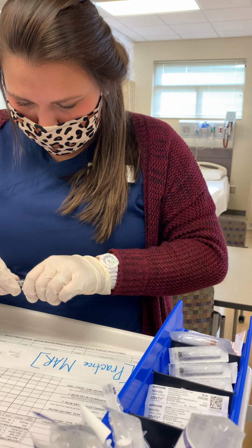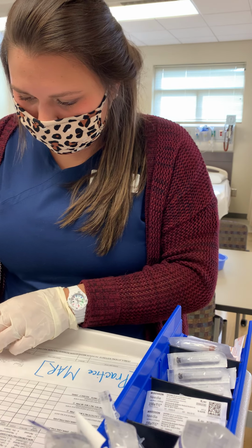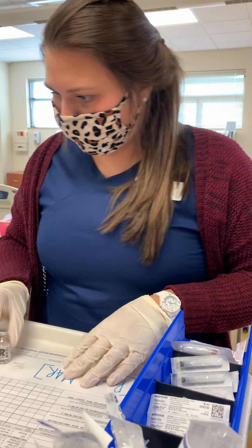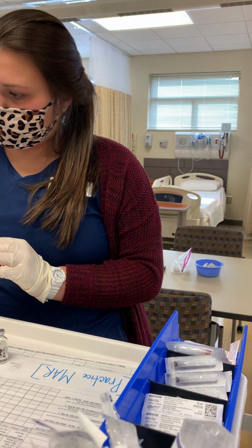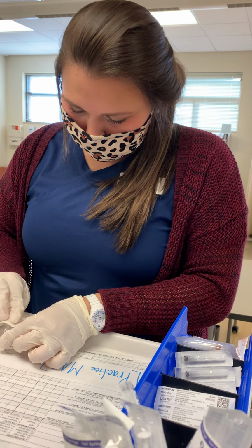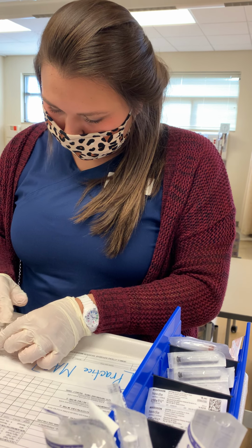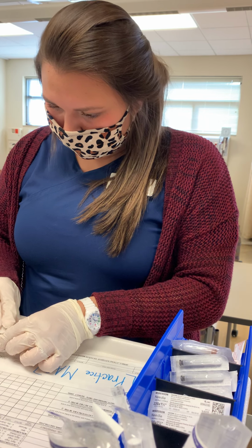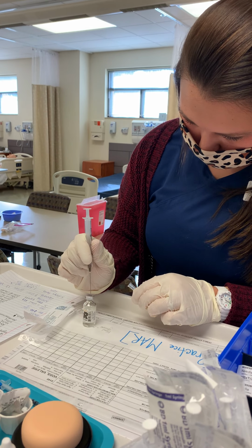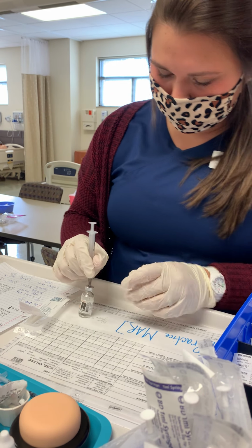I'm going to place my needle in here. Going to wipe my valve for 5 seconds. All right, I'm going to inject 1 mL of the hydromorphone HCl.